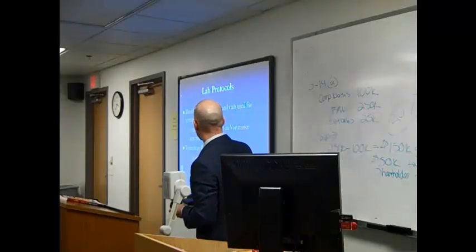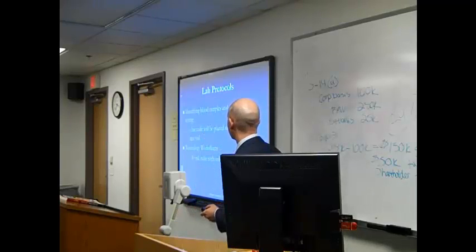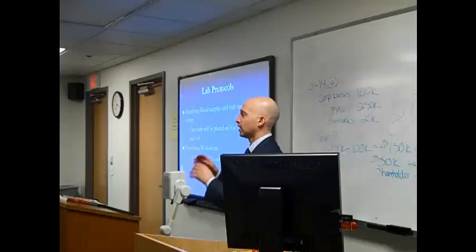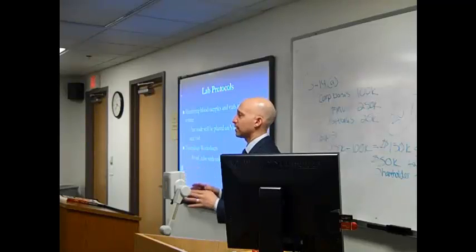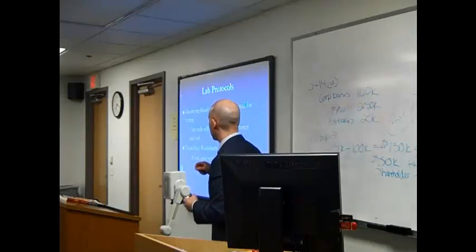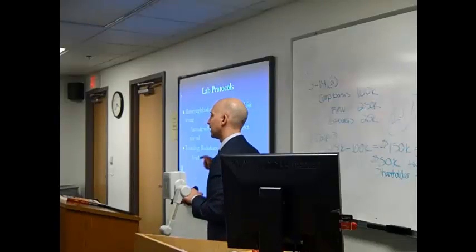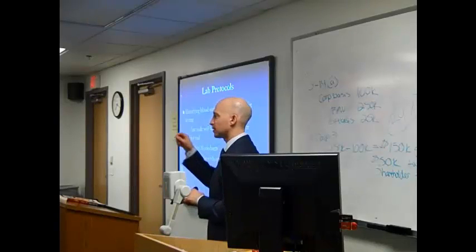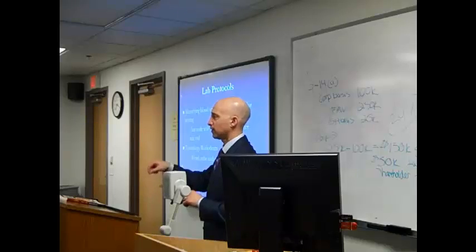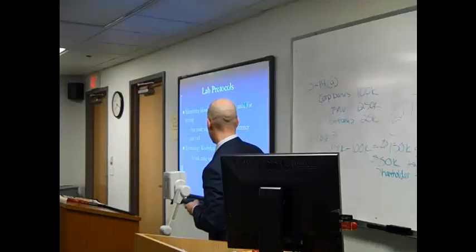All right, so there are lab protocols that need to be followed. The vial itself has a barcode on it, and that's going to be used to identify when it's being tested. So as I said, there's going to be a whole run of a whole bunch of samples, which are called unknowns. You don't know what's in the sample. The vials all have barcodes on them, and that's typed into the computer, and then each little vial is placed into a part of the carousel, given a number, typed in the computer, and correlated to the actual barcode.